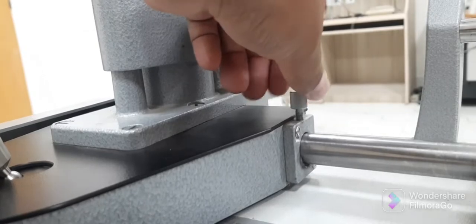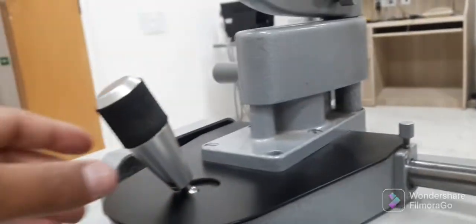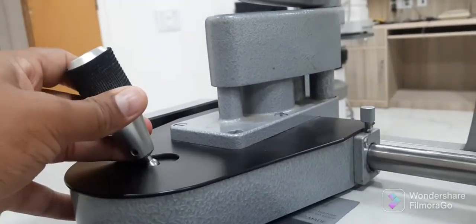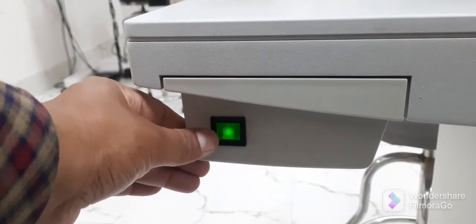is to unlock the slit lamp so that it can move in the desired direction by moving with the joystick, and after that switch on the slit lamp by switching on the power button.